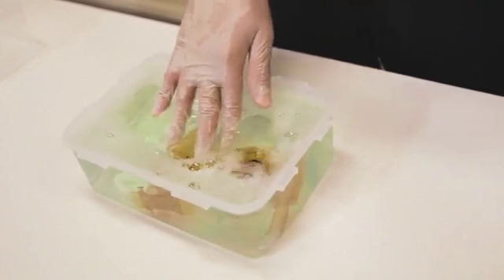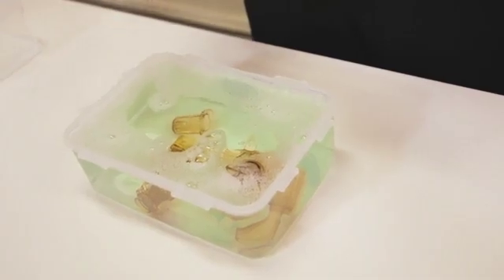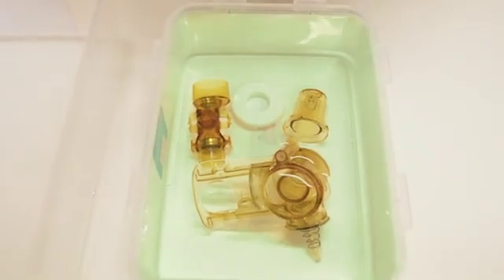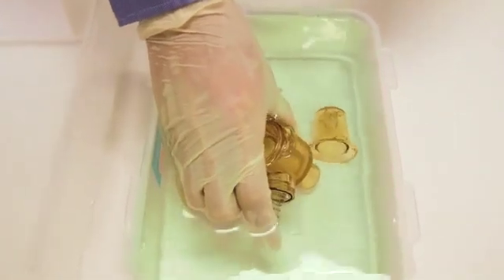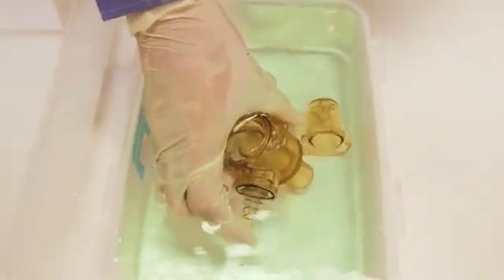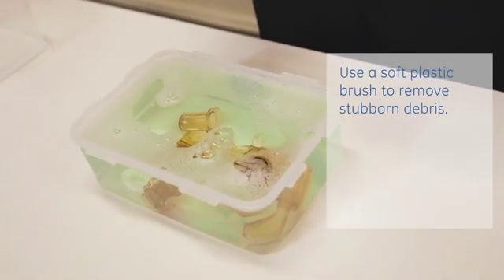Gently agitate the parts under the solution to remove and dislodge any debris. Submerge the exhalation valve assembly in the solution and push down on the spring-loaded plunger repeatedly. Use a soft plastic brush to remove stubborn debris from the external surfaces.